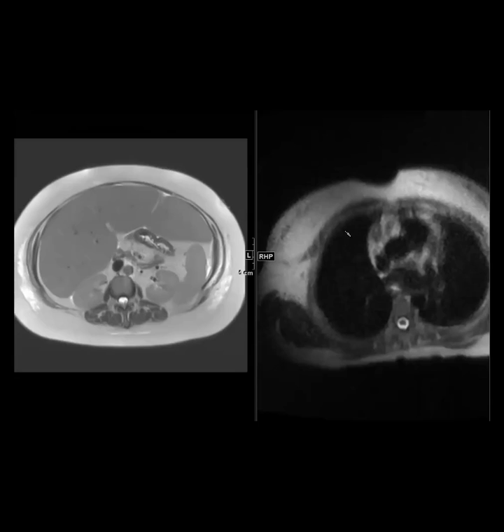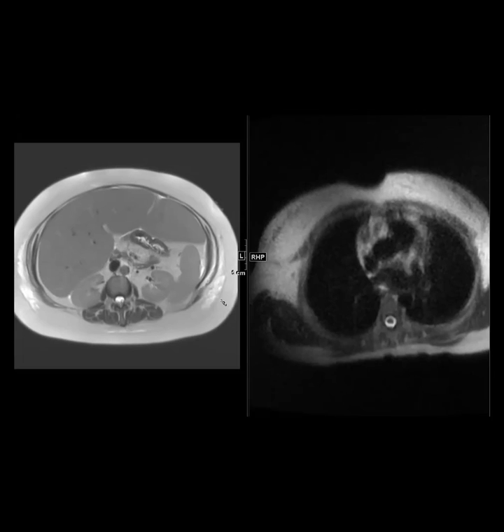I have a weird case from WashU where a sickle cell patient had a myelolipoma, and they had a follow-up MRI 5 years later, and it was 3 times the size. I didn't know if it was something with the bone marrow. Ooh, changes of extramedullary hematopoiesis in the myelolipoma. I couldn't find anything in the literature.